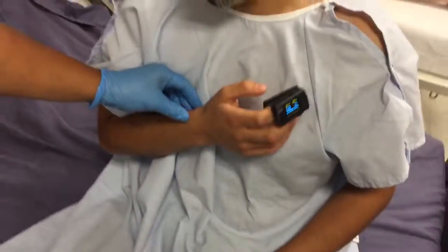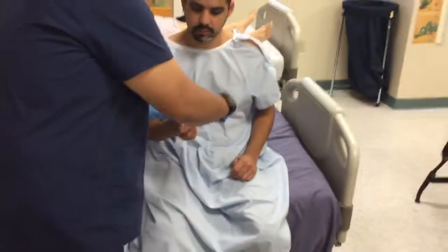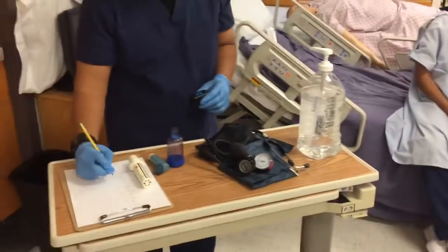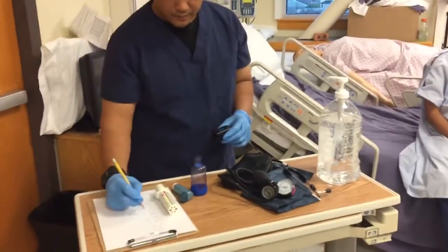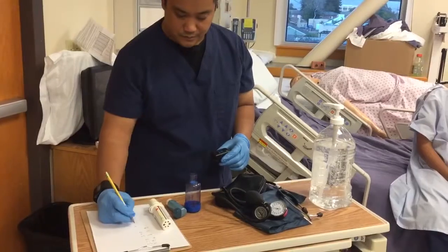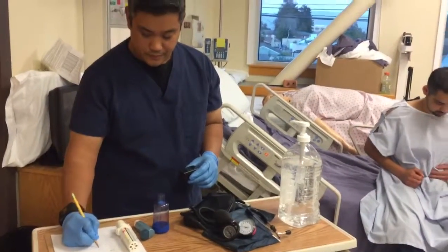All right, thank you, Christian. Go ahead and take this right here. So we got sats at 98 and heart rate 68.